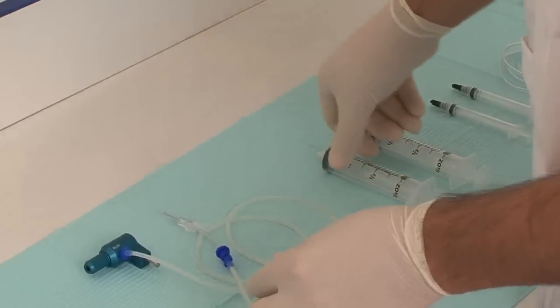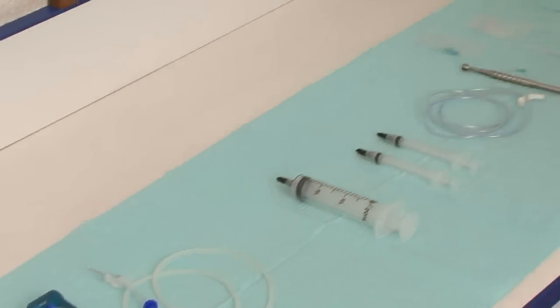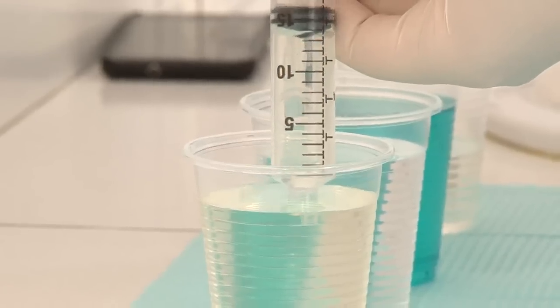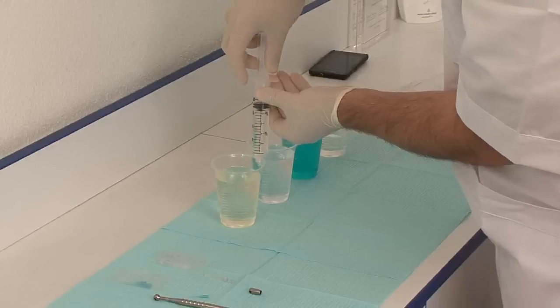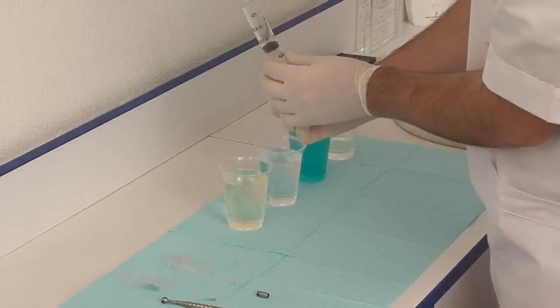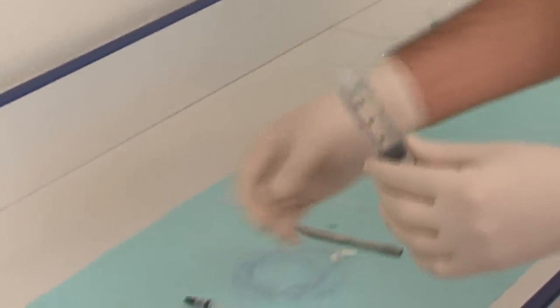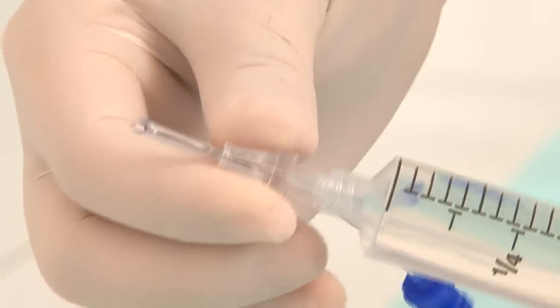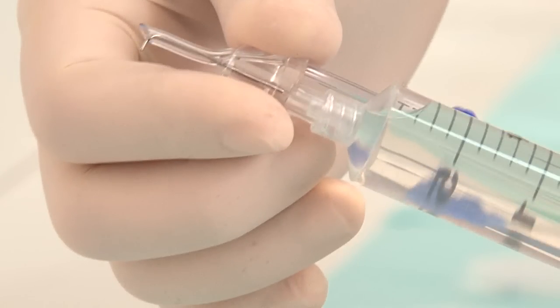We load the main syringes with sodium hypochlorite. And we adapt them to the master delivery system tip that contains a beveled needle that will deliver the irrigants inside the access cavity and then be taken out from this plastic suction that is connected to the suction device in order to create this current of fresh irrigants inside the access cavity.